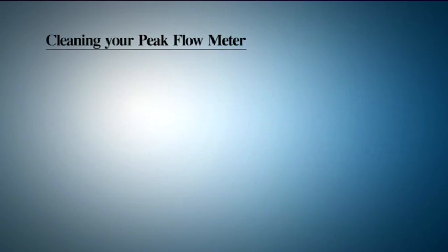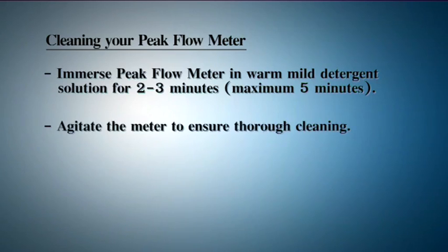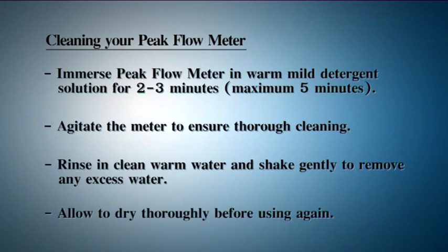Cleaning your peak flow meter. Immerse the peak flow meter in a warm, mild detergent solution for two to three minutes, maximum five minutes. Agitate the meter to ensure thorough cleaning. Rinse in clean, warm water and shake gently to remove any excess water. Allow to dry thoroughly before using again.